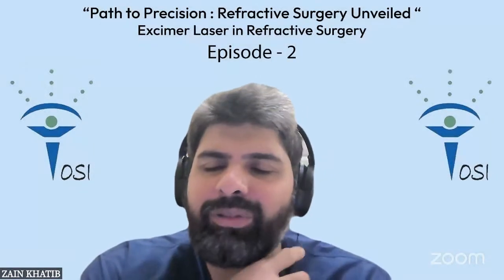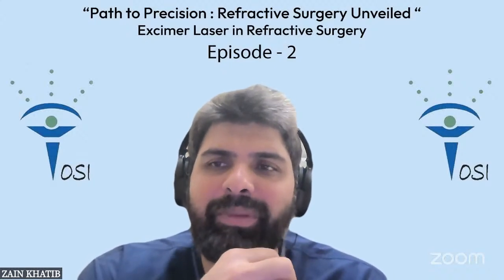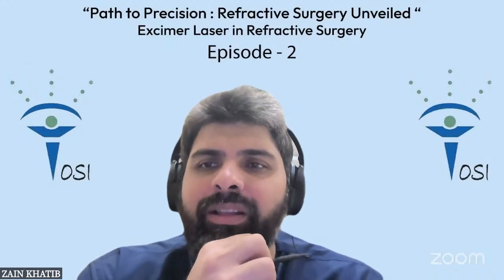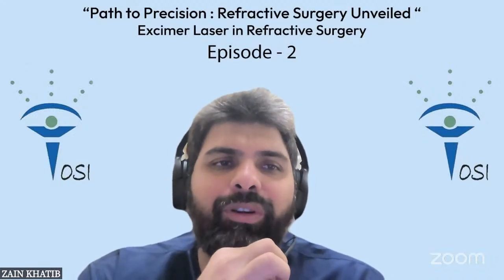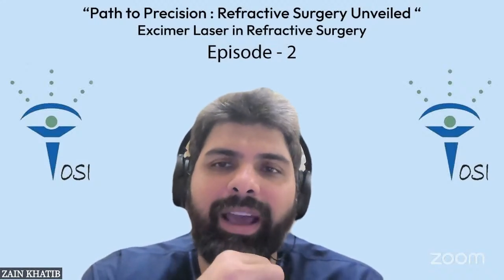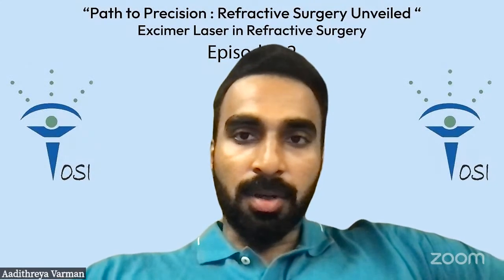Just to add to that, apart from the microfolds part, the marking is extremely important. Some people would recommend that if you're doing a femto LASIK, you need not mark. But I would say marking is important because it also helps you align the flap intraoperatively. Even if you're doing a femto, at least as a beginner, you mark and you try to align the flap best to the marks post-surgery. Very true. Even though I don't do MK anymore, all my femto flaps I still mark.